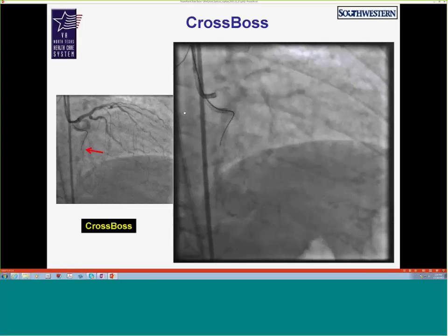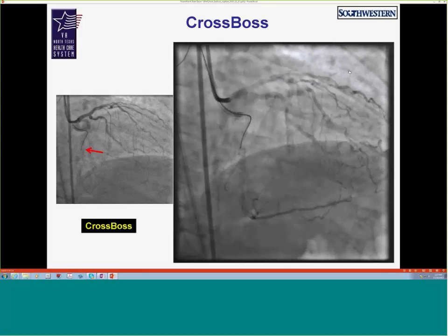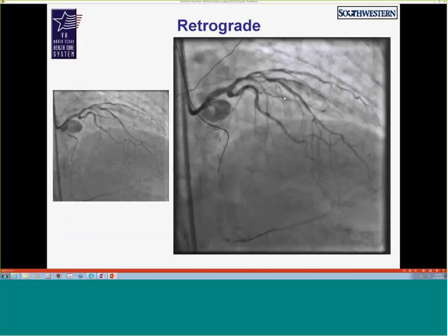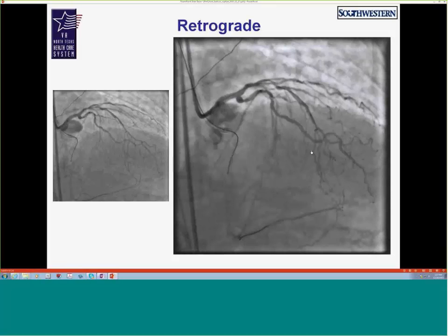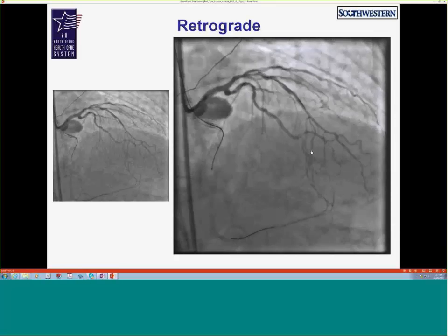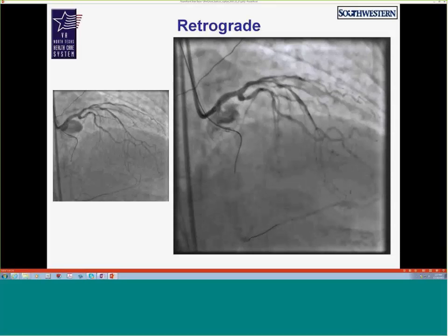So any thoughts at this point? Actually, it's a good view because it shows some of the collateral as well. Yeah. So the problem here is we tried antegrade. We tried both with a wire and with the CrossBoss, and we don't make any progress. So that's the importance of knowing retrograde, because in cases like this, where nothing else seems to work, retrograde can provide you a nice bailout option.